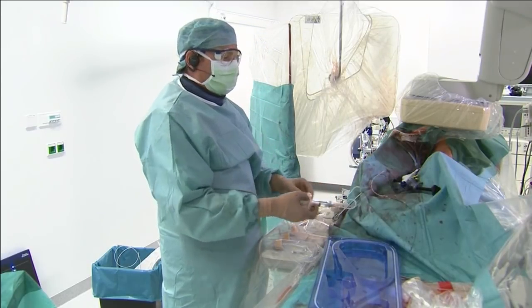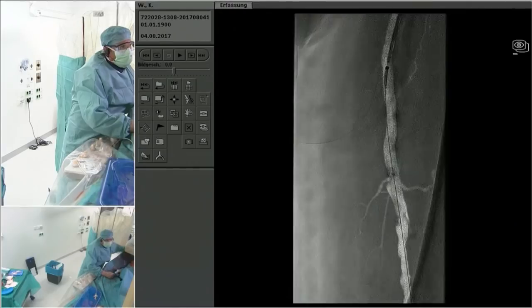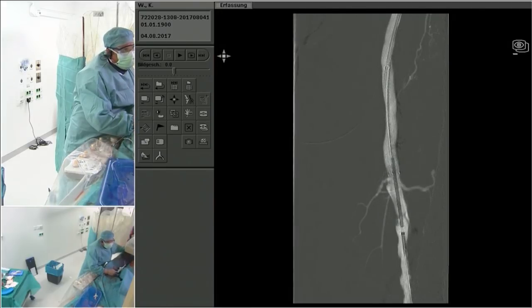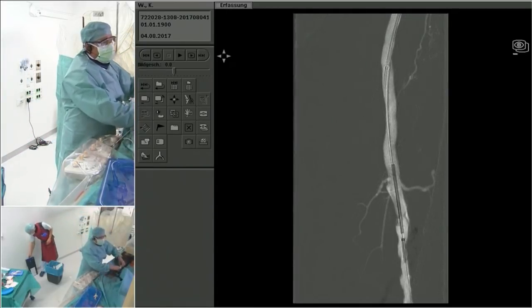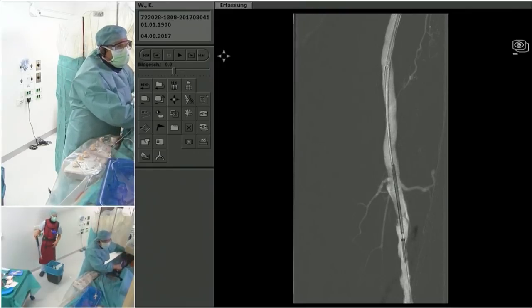Yeah, I agree. The diligence to vessel prep here and the diligence to post-stent optimization really was remarkable. Absolutely. So please tell us what stent you are placing, and we are soon going to go over to the other room where Andrej is starting the second case.